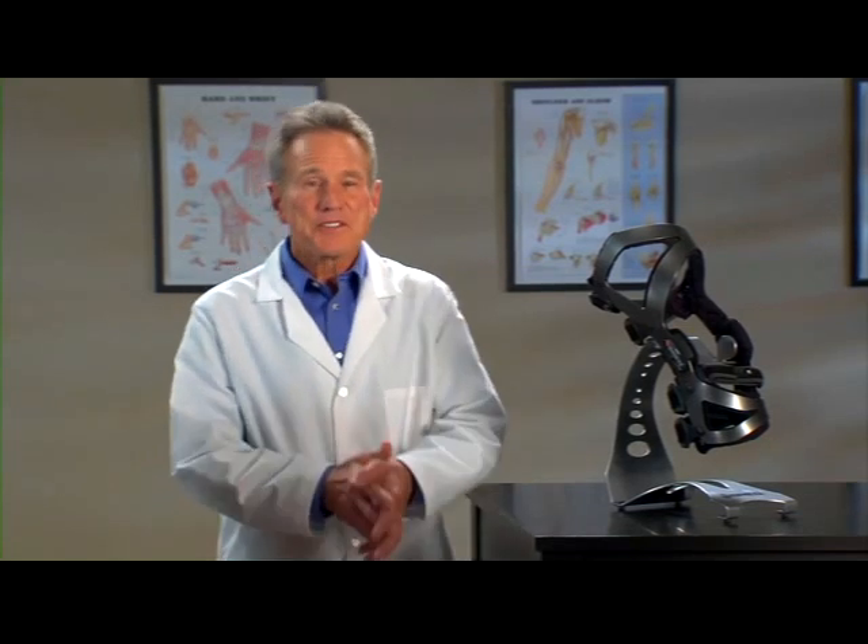Hi, I'm Jim. I'm here to tell you about the brace chosen specifically for you and your condition. It's from Bregg and it's called the LPR Knee Brace.